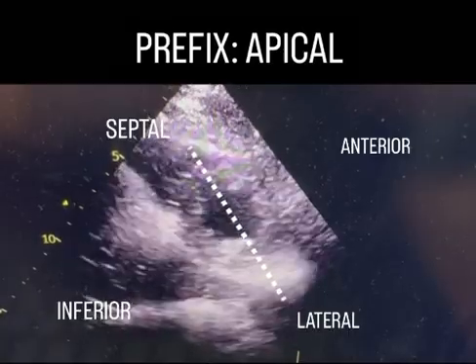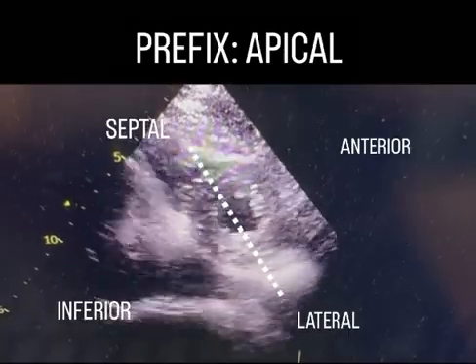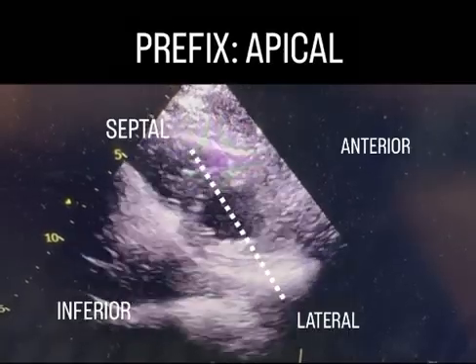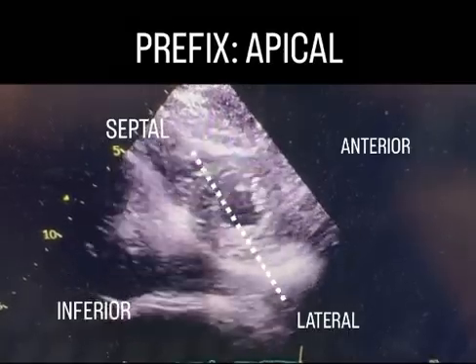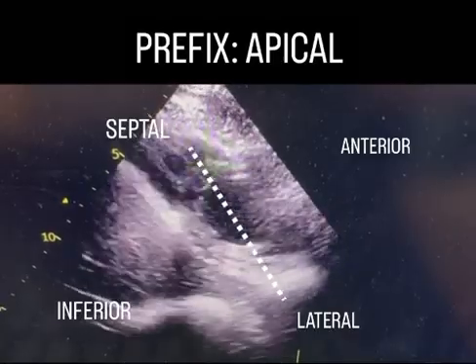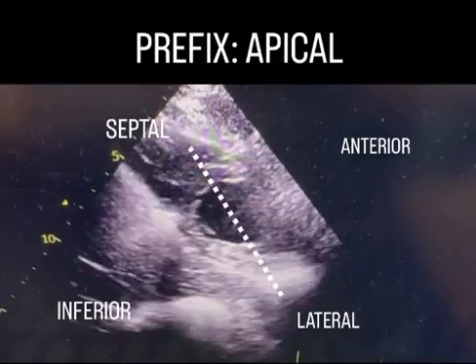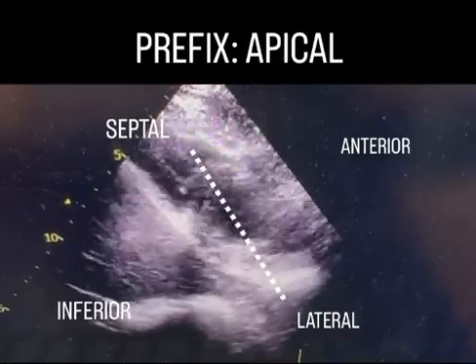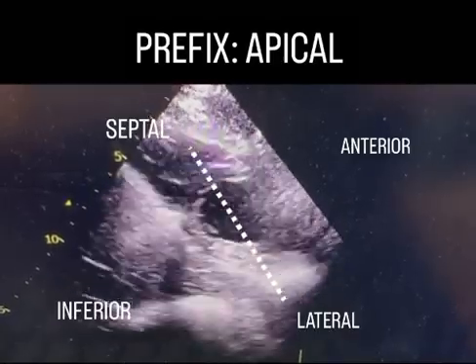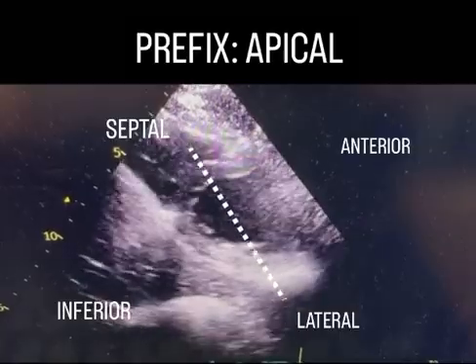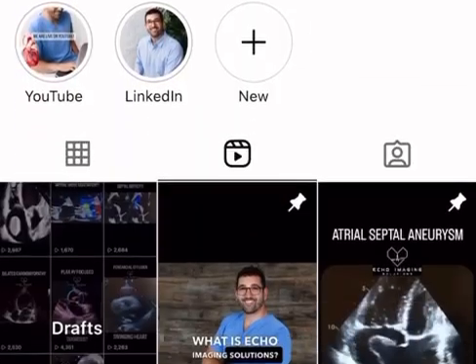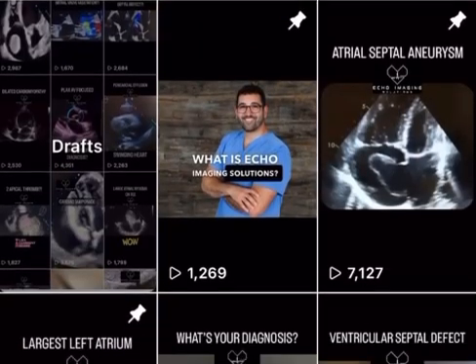Now that we have seen all of the short axis views of the left ventricle, it is important to note that we will see all of these segments in the apical images as well. If there is suspicion of hypokinetic or akinetic wall segments, it is crucial to see that in two views.